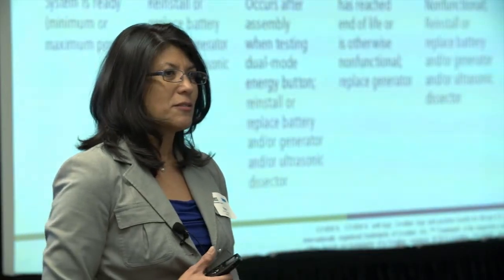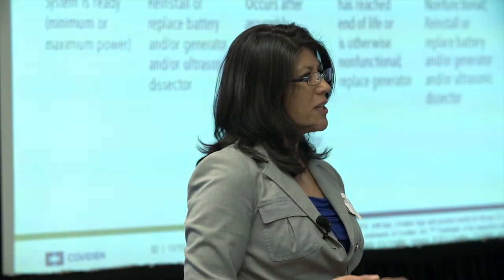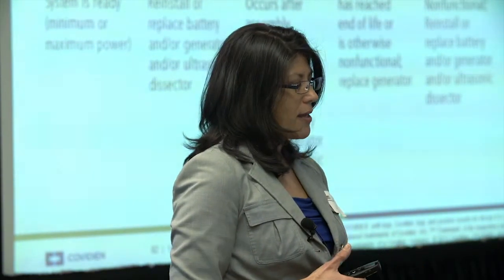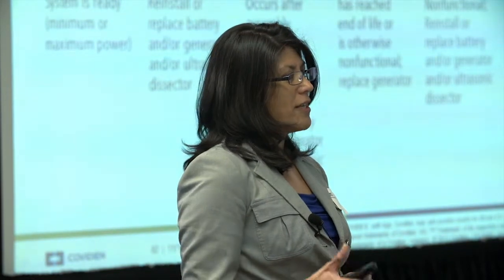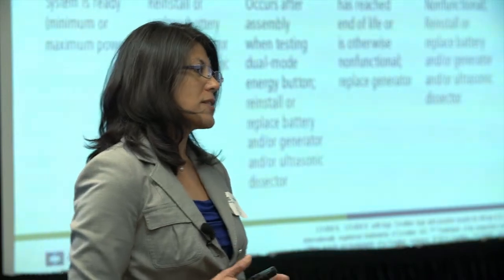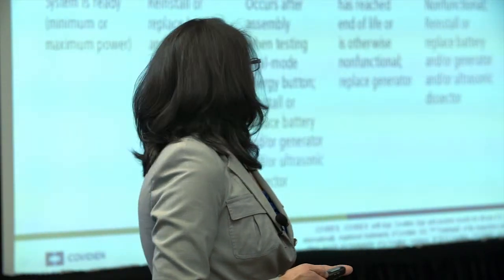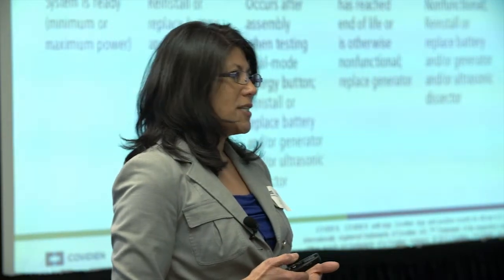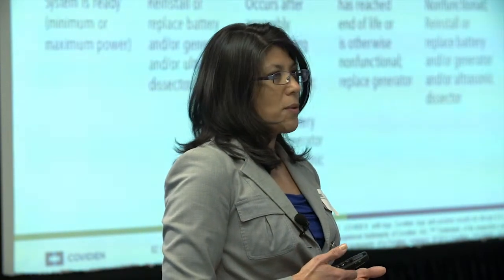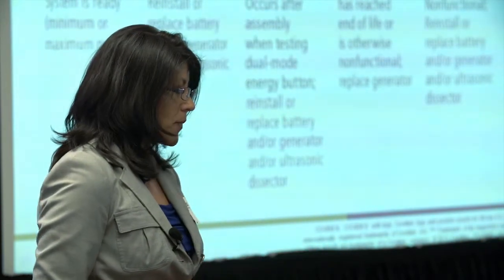Everybody has an opinion of what the color should be, what the sound should be. So we really tried to simplify so that we could give whoever that scrub nurse or the surgical tech that confidence that they would know that the device was working. We leveraged off of what does the user need to know, and then if there was a problem, would they recognize it, and what would they do to fix the problem?